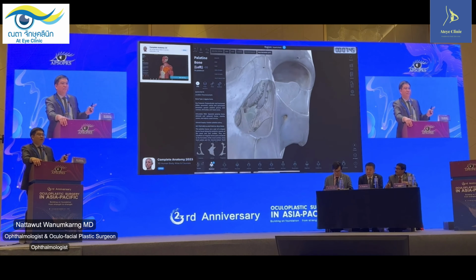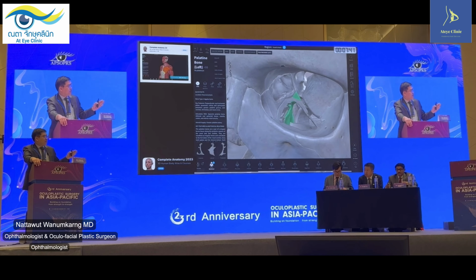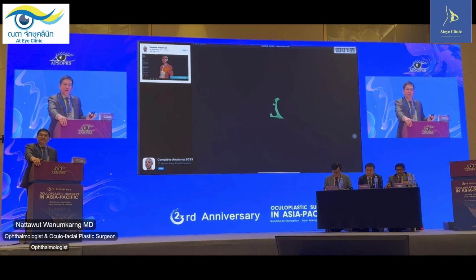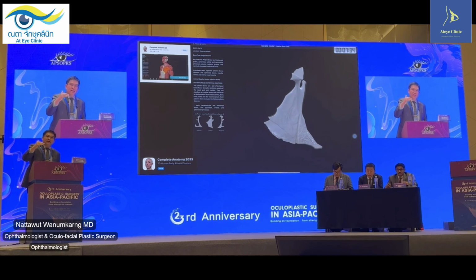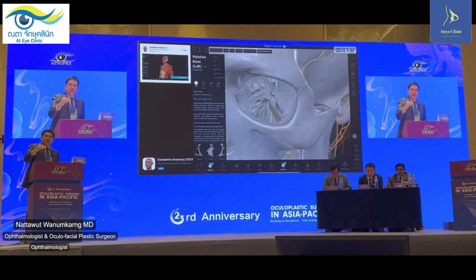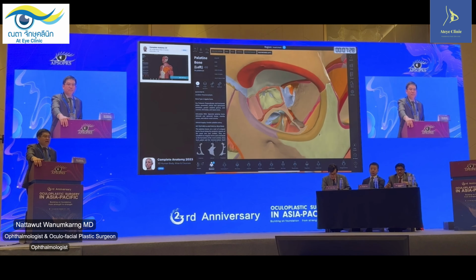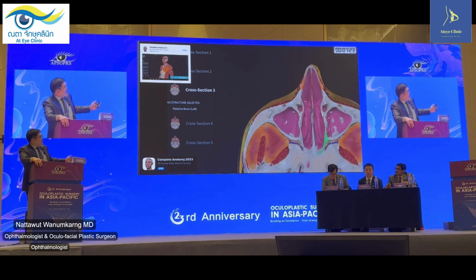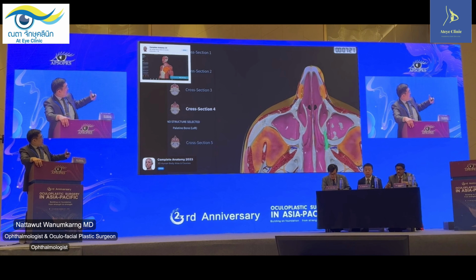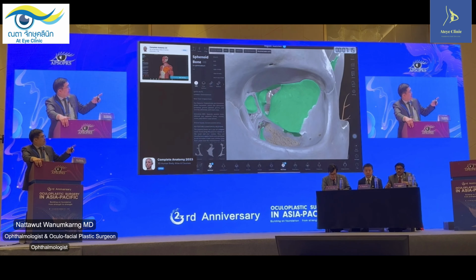This is the palatine bone, orbital plate, and the body and articulation surface of the palatine bone, which are going to be well understood by the surgeon. That allows you to study and learn how intact the palatine bone is before you put in the orbital implant. If you have a strong orbital palatine bone, you can see it in the cut, like an axial view, and study the strength and the integrity of the palatine bone.